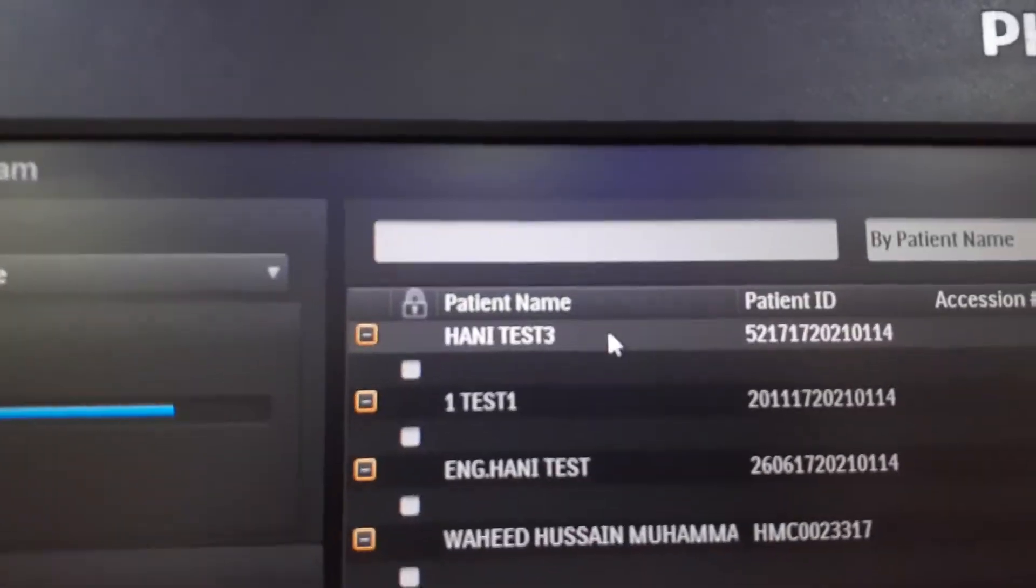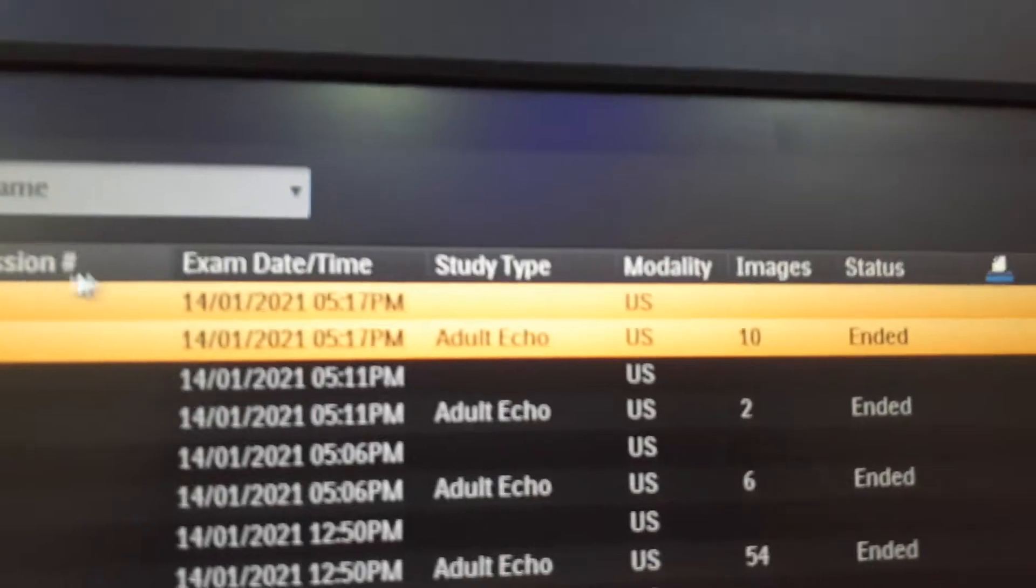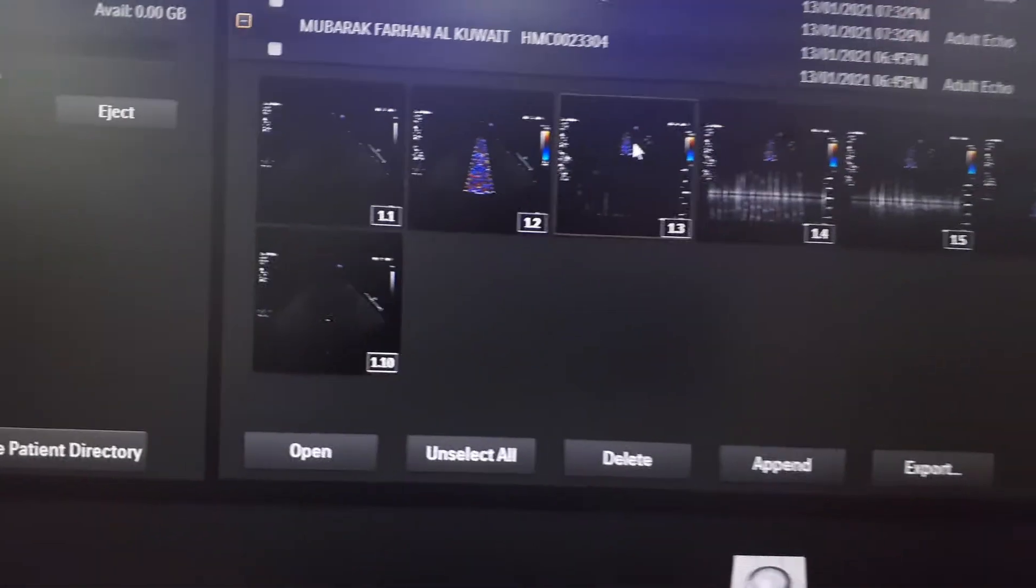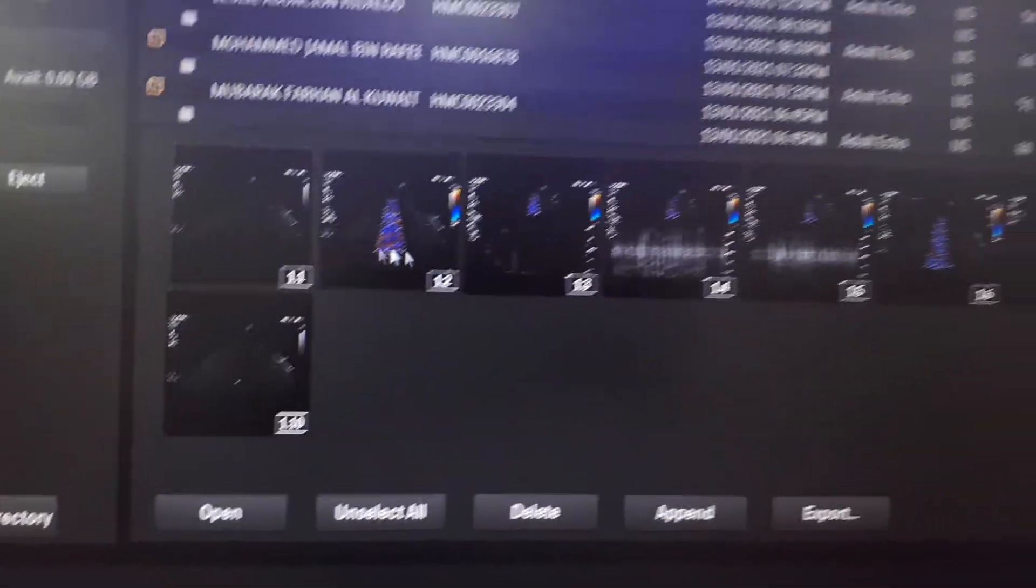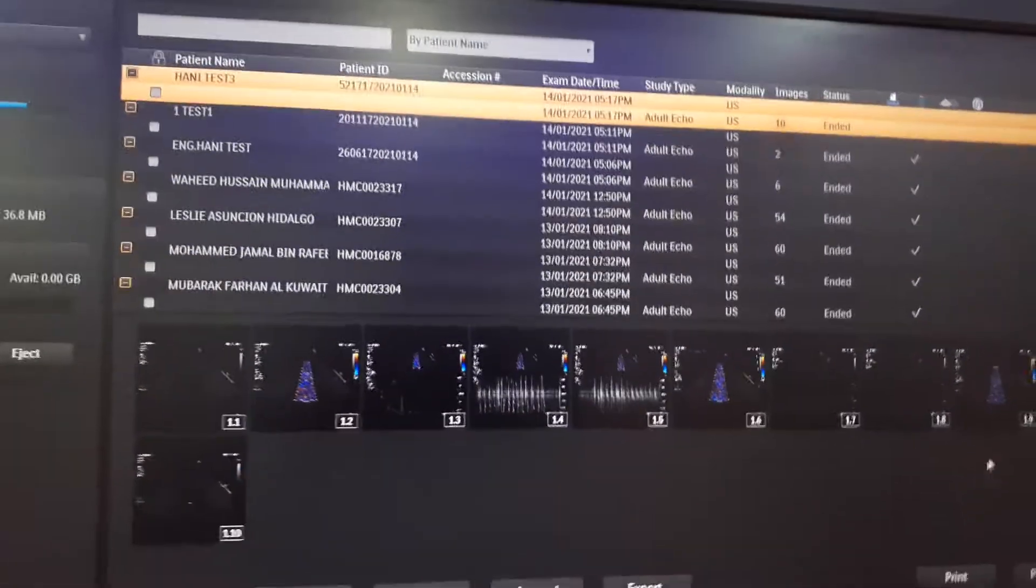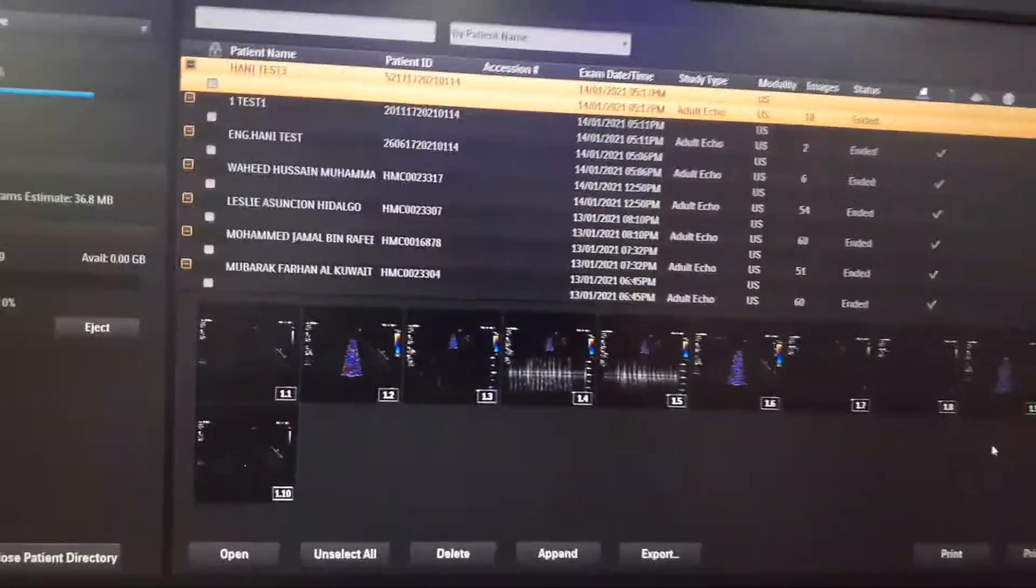You will see 10 images. Seven of them are clips, Cinelook clips, and three of them are pictures only. The data size for this study is about only 36 megabytes.